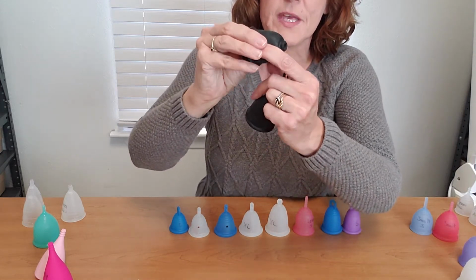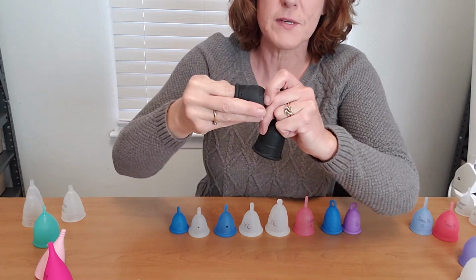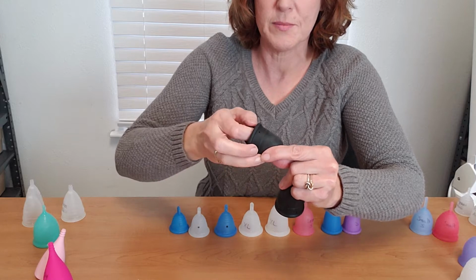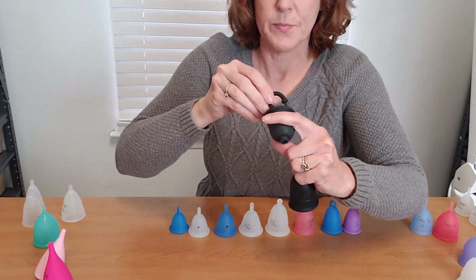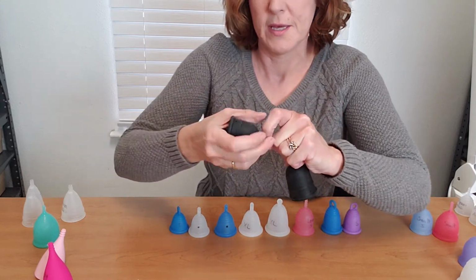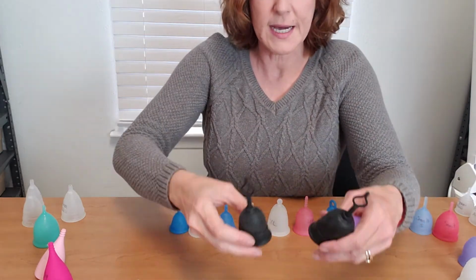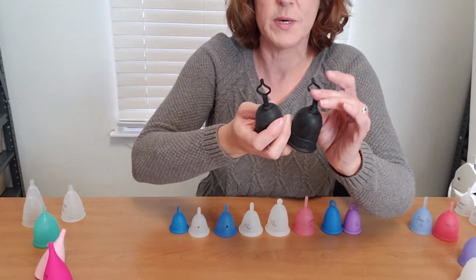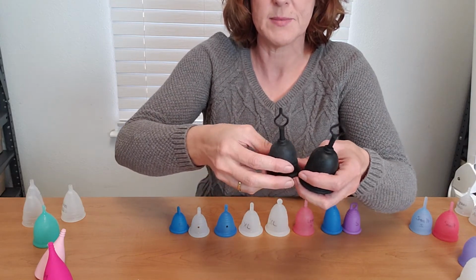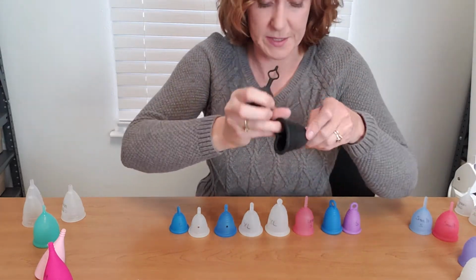If you've seen our other videos, the ones to review would be what to do if your cup handle is too long, and also how to remove your menstrual cup, because you will know that a super long handle doesn't really help you if you can't break the seal before you pull it out. So these guys tend to bother people mostly because there's so much handle on them, and also because then it seems like the cup is too long when really it's just all this business going on at the bottom of the cup that's bothersome.